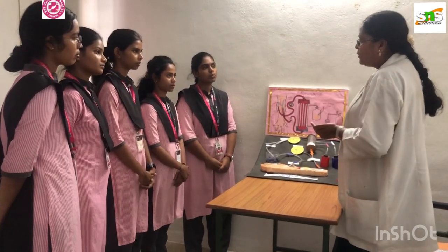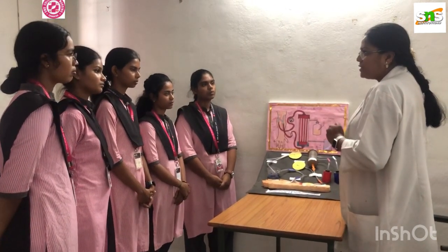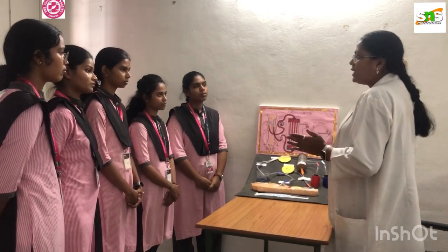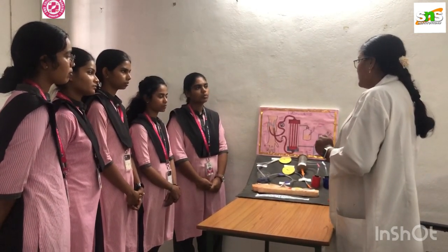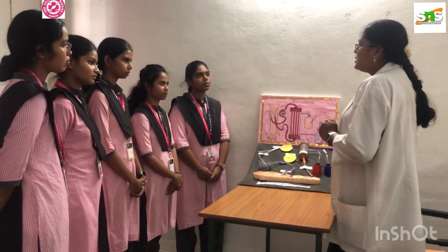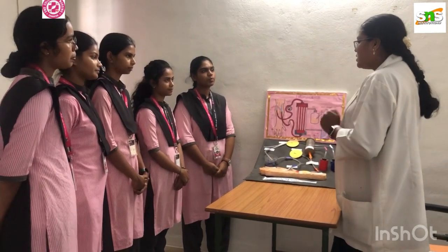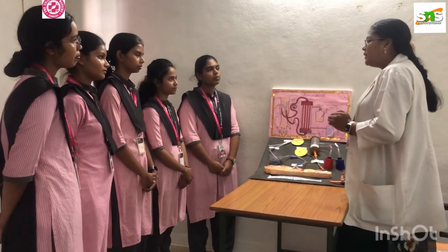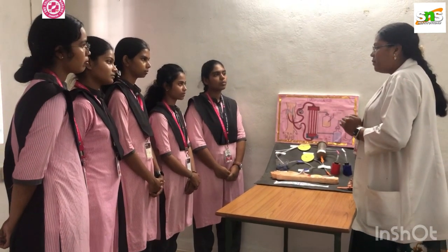The accumulated electrolytes will cause trouble to the normal hemodynamics of the body. So we need to excrete the electrolytes and all other waste products out of the body. The technique used is called hemodialysis. Have you heard about this? The patient who is in complete renal failure, acute or chronic, will undergo this hemodialysis.